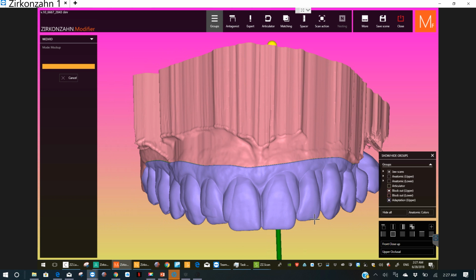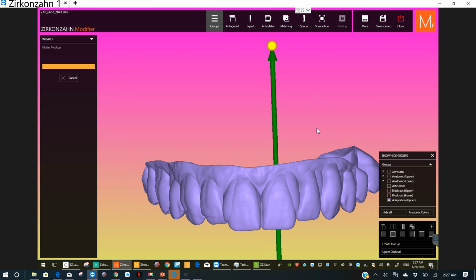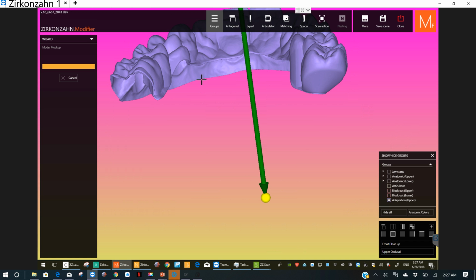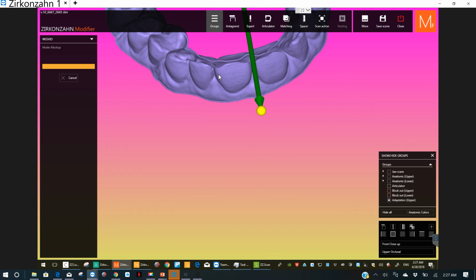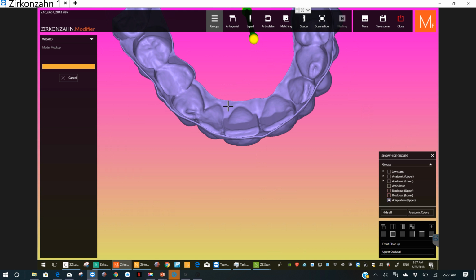All right, I'm gonna hold down Control to get rid of this top model so we can look inside it. Ooh, that was the block out. Now here's the real model. But check out inside this thing. So this is with a 2-degree block out. It looks like it should slide on okay.